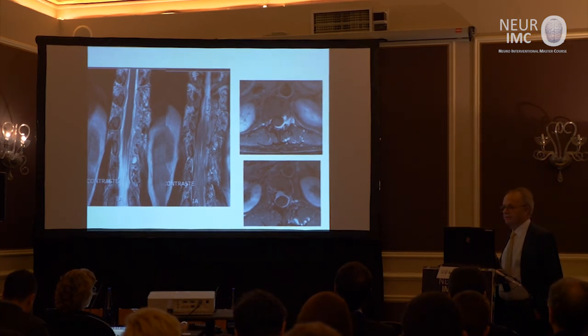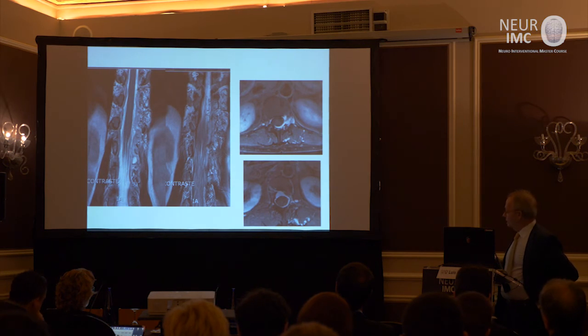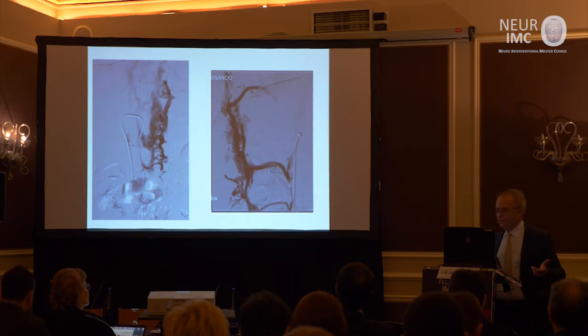Angiographic, arterial and medullary, there is no lesion, normal. The venous drainage is normal. At the same time, I have this imaging, I decided to check the venous component in the spinal region, and look, this is the AP view and lateral view, the vein, and you see hypertrophy on the drainage of this vein in the canal and in the foramen. This is the origin of the pain of the patient.